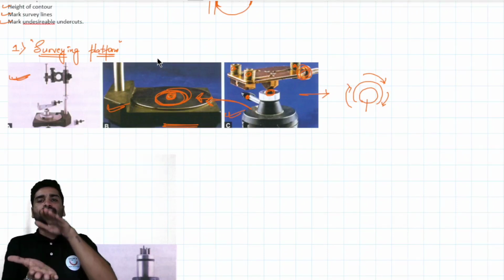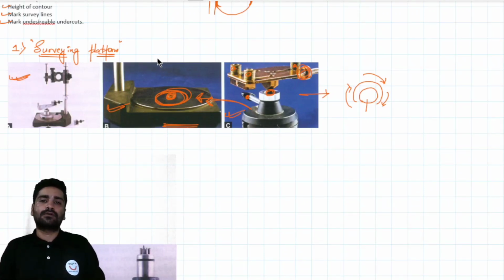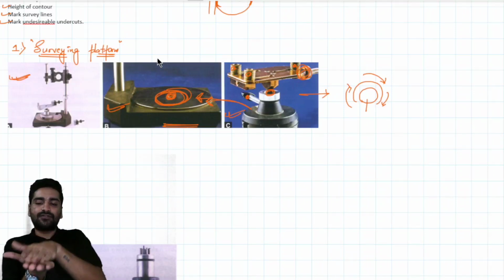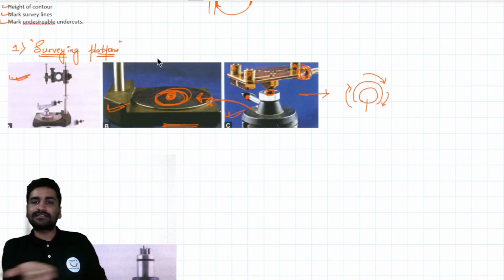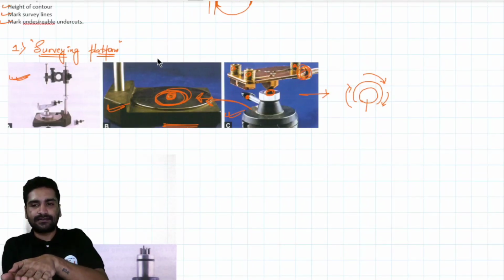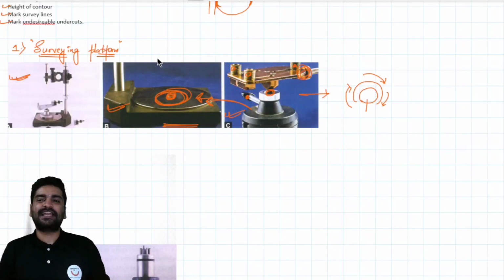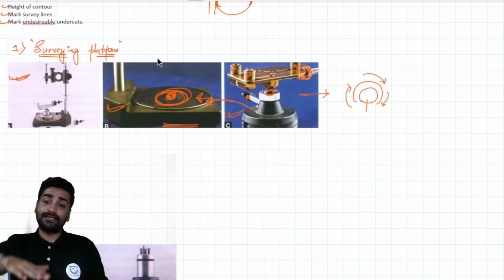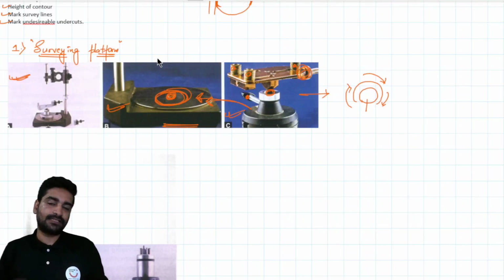It is not always necessary that you keep the cast holder exactly parallel to the floor. Sometimes the path of insertion will not be so good at that degree of tilt. That is, if you have a 0 degree of tilt, you may feel that if you tilt the cast holder by 5 degrees, you get a better design of the RPD. See, the tilting of the cast can change your design of the RPD. Yes, this you will understand when you go through the process of surveying.